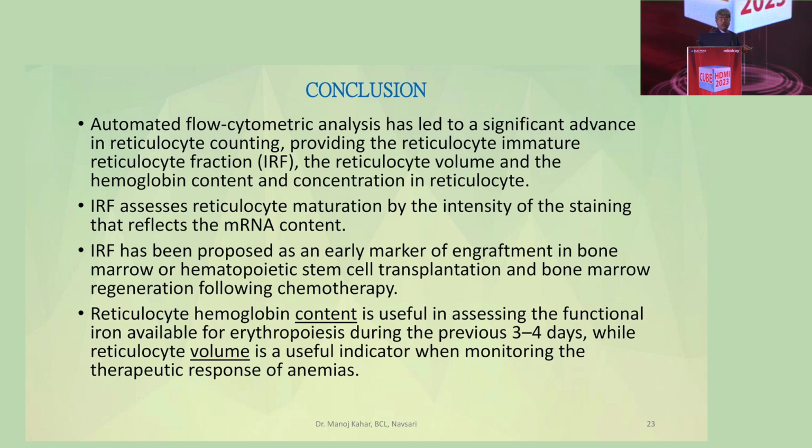Reticulocyte hemoglobin content is useful in assessing the functional iron available for erythropoiesis during the previous 3-4 days, while reticulocyte volume is a useful indicator when monitoring the therapeutic response of anemias.